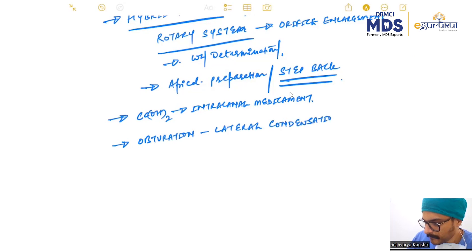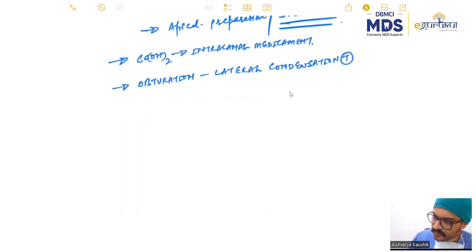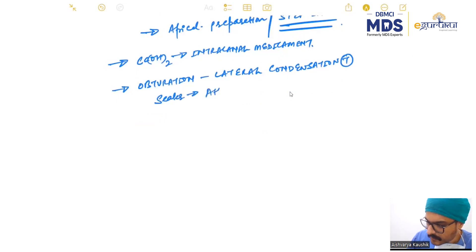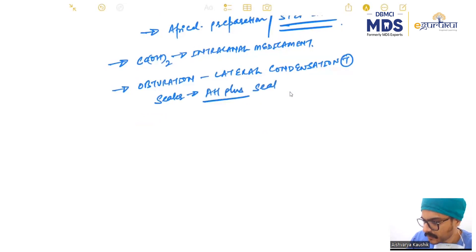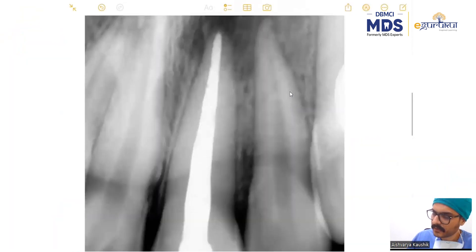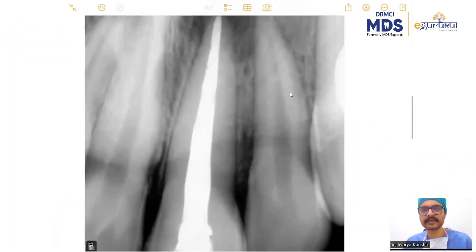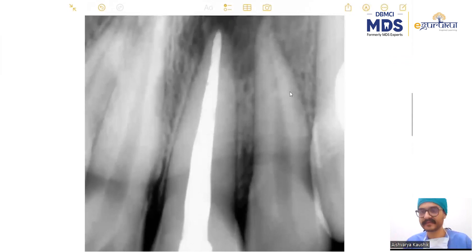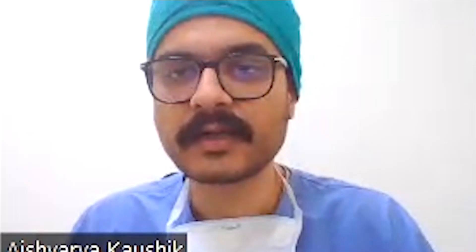The sealer we used was AH Plus. That's how the obturation looks — you can see the nice radio opacity. AH Plus sealer has great radio opacity. So that was the case for today.